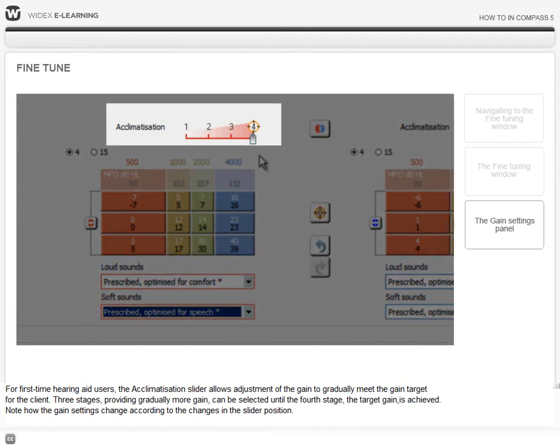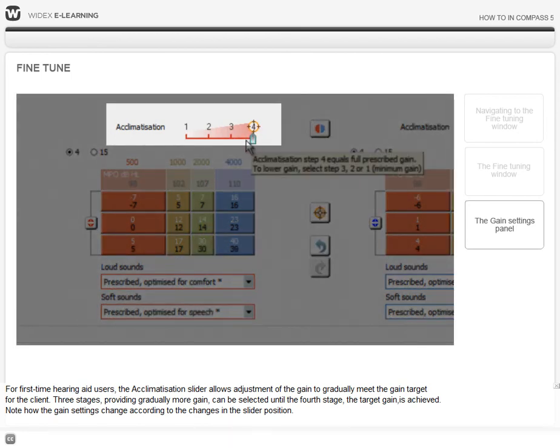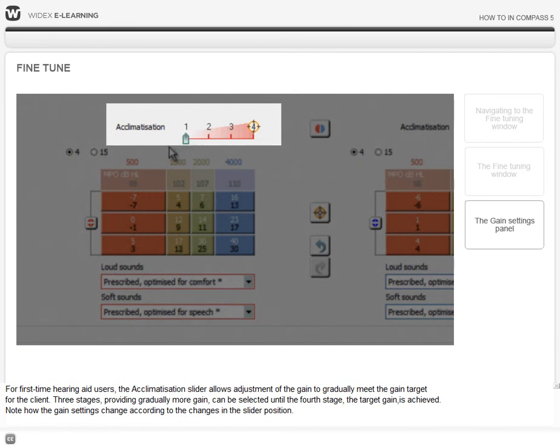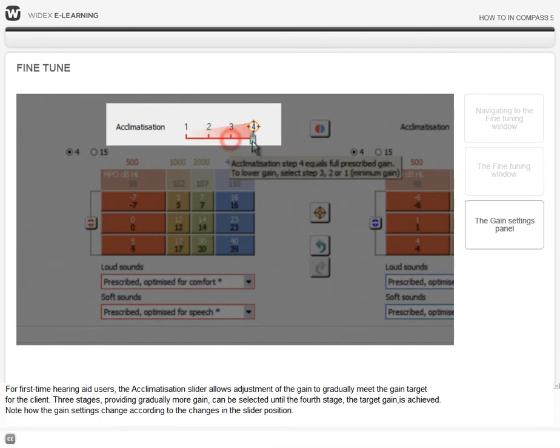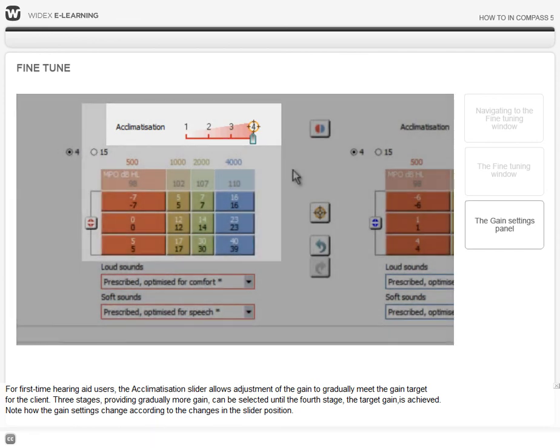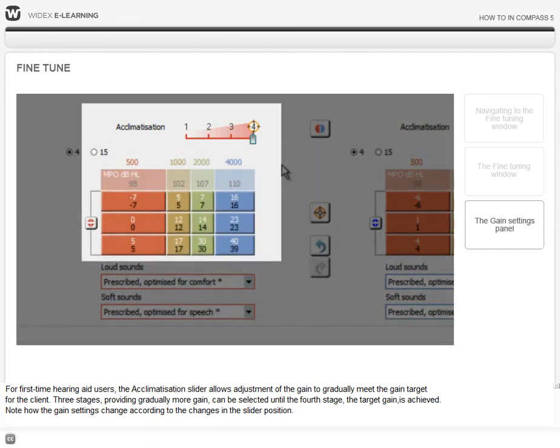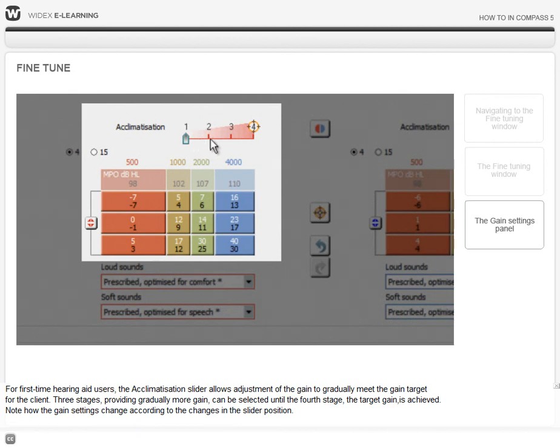For first-time hearing aid users, the Acclimatization slider allows adjustment of the gain to gradually meet the gain target for the client. Three stages, providing gradually more gain, can be selected until the fourth stage, the target gain, is achieved. Note how the gain settings change according to the changes in the slider position.